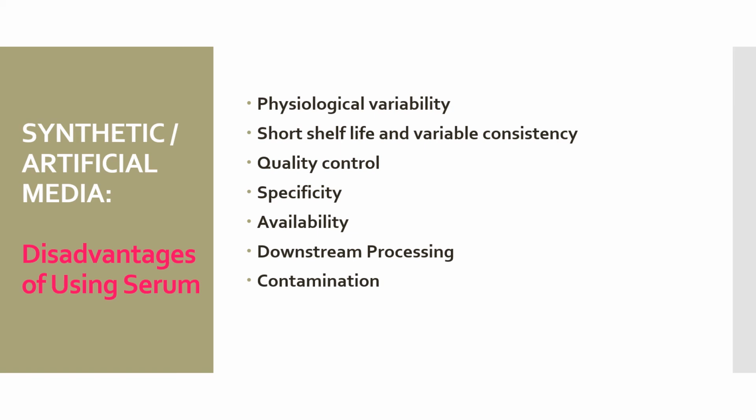Risk of contamination. Serum is frequently contaminated with virus, which is an unwanted factor, even if it may be harmless to the cell culture. Cost. Serum supplementation increases the cost of the medium because serum constitutes a major part of the cost of a bottle of medium. Apart from its growth-promoting activity, serum also contains certain factors that may be growth-inhibiting to some cell types.